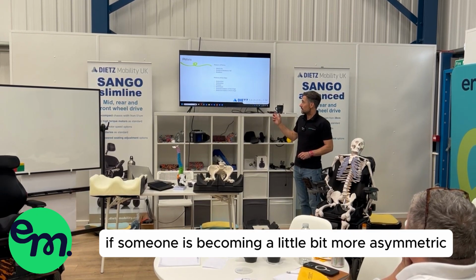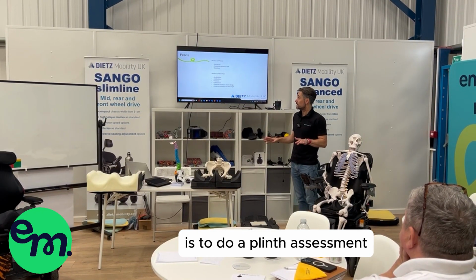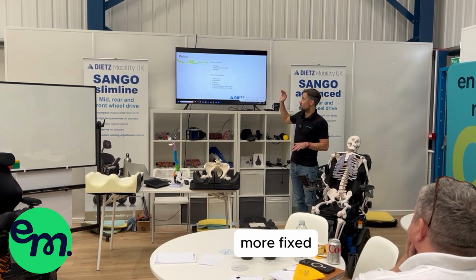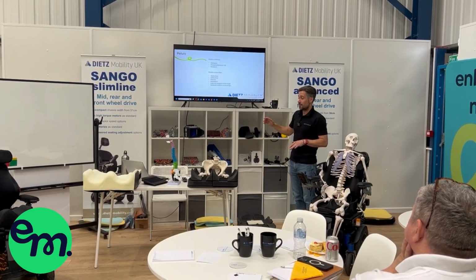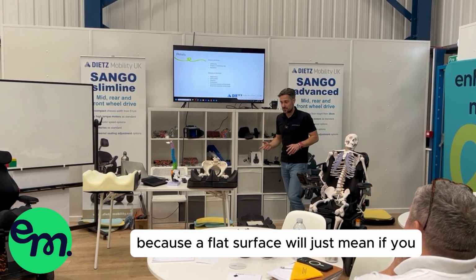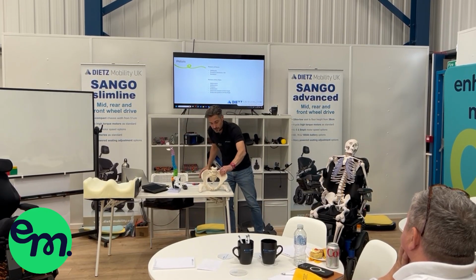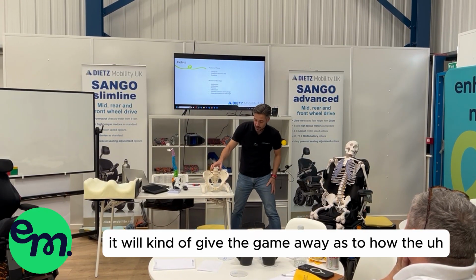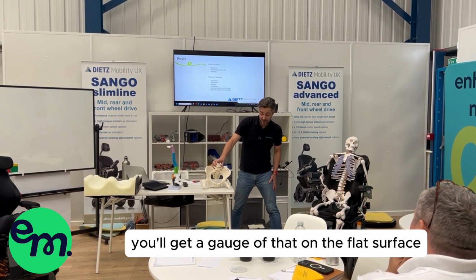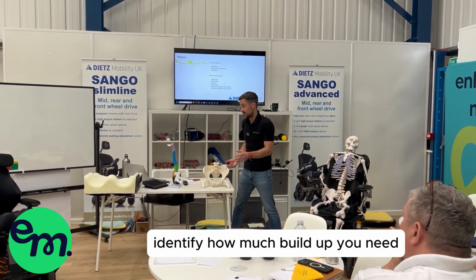I would, if someone is becoming a little bit more asymmetric. That's the point where a baseline measure is always to do a plinth assessment. By doing that, you can ascertain whether the pelvis is in any of these more fixed components. If you're sitting on a flat surface, you can gauge what level of obliquity the person has, and posterior or anterior tilt. It will give the game away as to how the pelvis is actually sitting. So if it does drop down to one side, you'll get a gauge of that on the flat surface. It won't be masked by cushioning underneath it. That way you can start to identify how much build-up you need, and where you may need it.